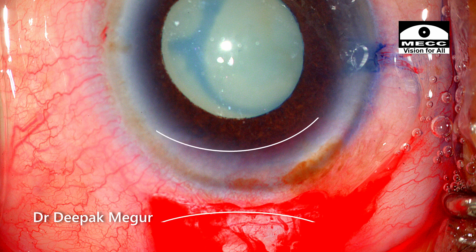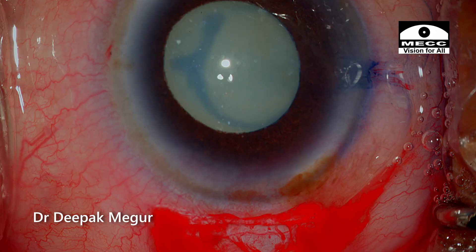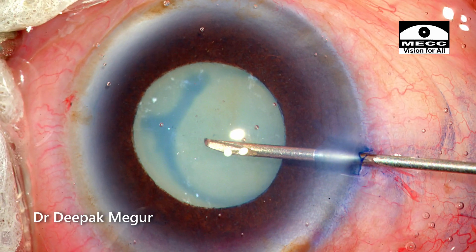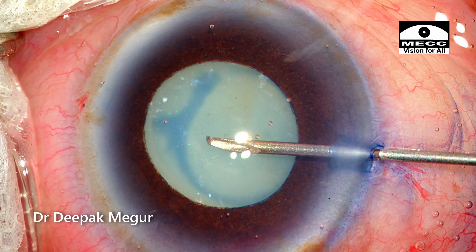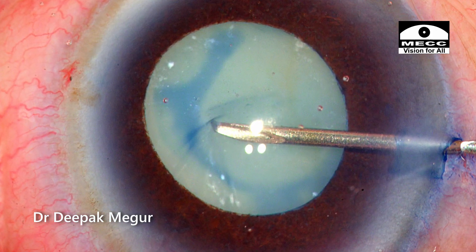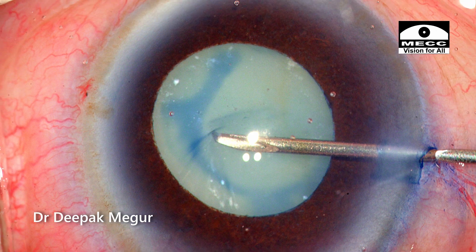We need to have this biconcave pattern of both the external and the internal incisions with respect to the limbus, which ensures greater stability of the wound and results in long-term refractive stability. Moving on, time to perform the most difficult step in this case — the rhexis. The anterior capsule will be very fragile and we have got specks of calcification, and of course we also have weak zonules in this case.